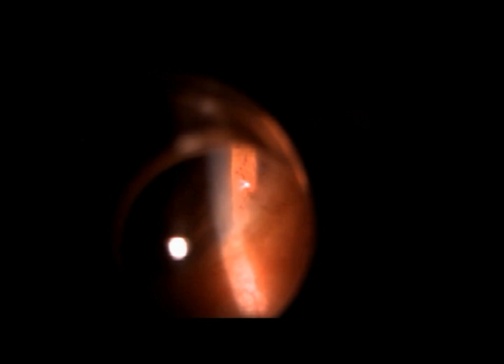Here we can see the magnified view of the crypt where the laser energy is being applied. The laser shot is given and we can see the iridotomy opening. Sometimes a single shot is enough to perform the iridotomy; sometimes the patient may require 2 to 3 shots, but multiple shots are to be avoided.